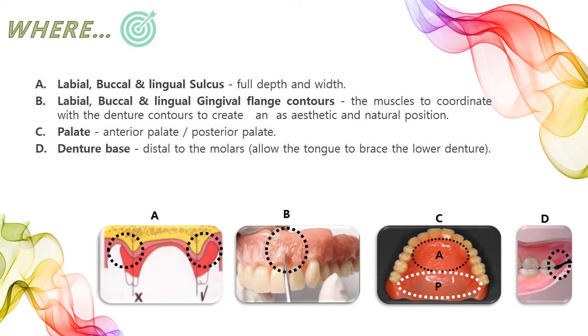The right time to perform this wax-up procedure is immediately after completion of the posterior setting as well as the establishment of the occlusion. This laboratory or preclinical work must be completed before we proceed with the clinical wax trial procedure.